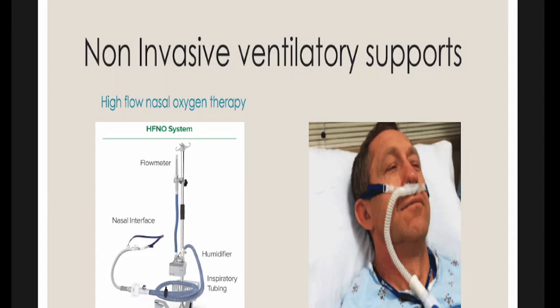Exhaled carbon dioxide is collected. Well, it can freely go out from the nostril. The patient can exhale nicely from the nostrils. But just imagine if the patient keeps his mouth open, or if he's a mouth breather, what will happen? The effectiveness of the ventilator is reduced. Yeah, of course.